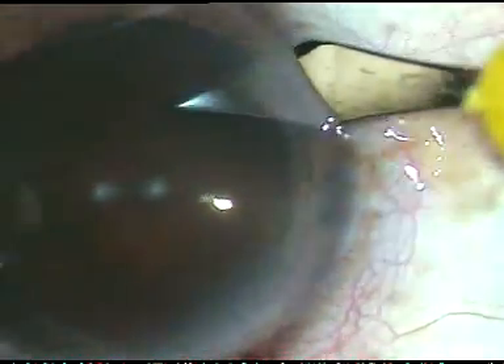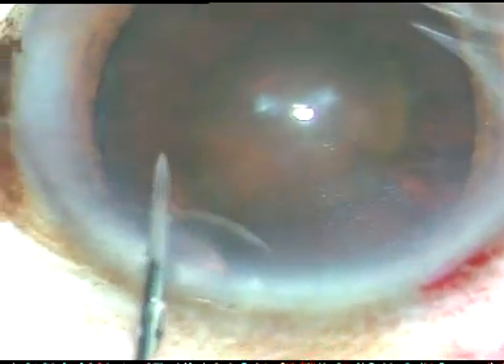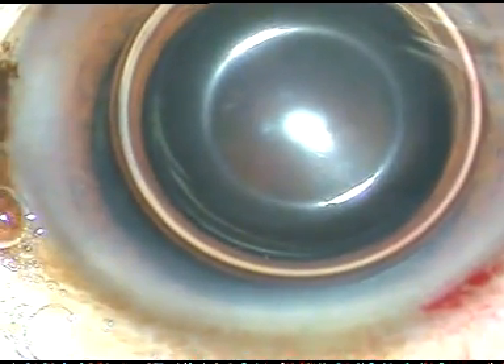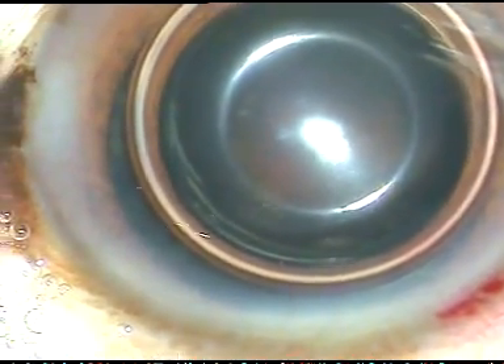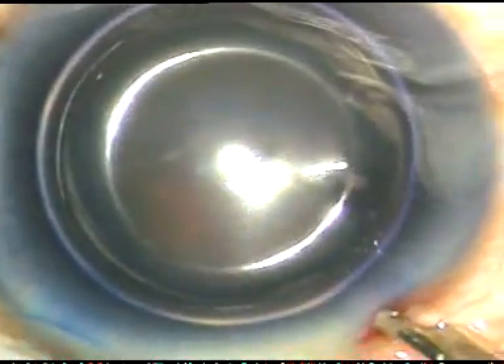By this time all the incisions have been made. Now I am going to inject a big air bubble in the anterior chamber. Trypan blue dye is being used to stain the anterior capsule so that rexis becomes easy. The dye is washed out.